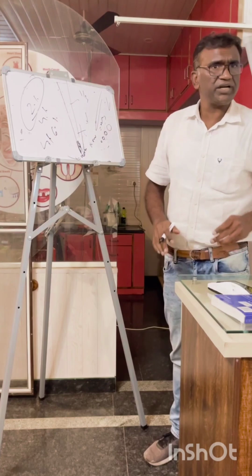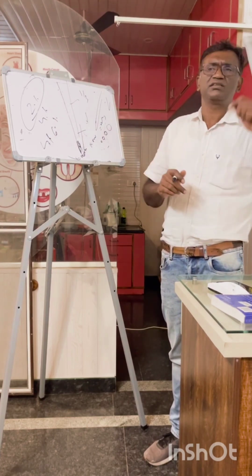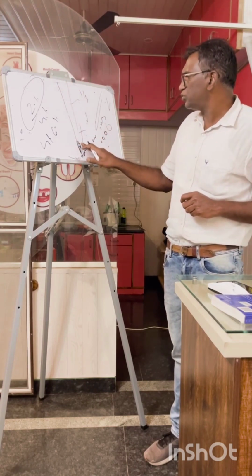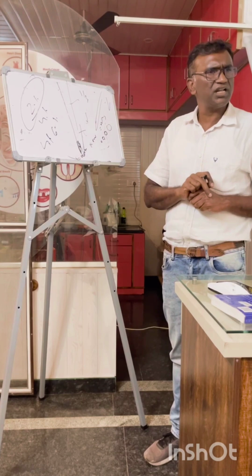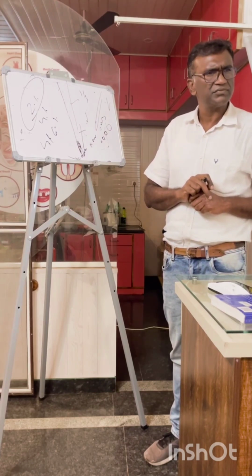Why increase your taper? What is the necessity? Taking the irrigating needle to the proper apex, proper irrigation, taking the irrigating needle to the root apex and proper hypochlorite irrigation. It means we have to widen the canal.